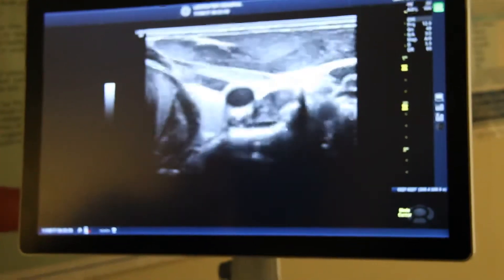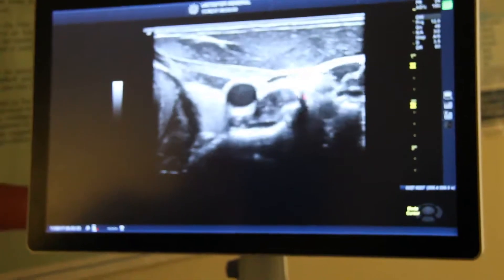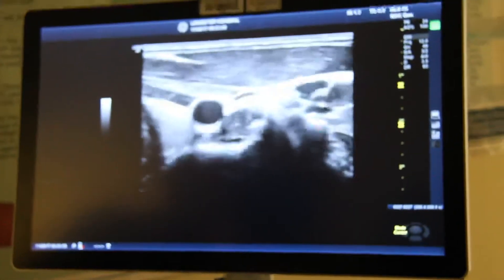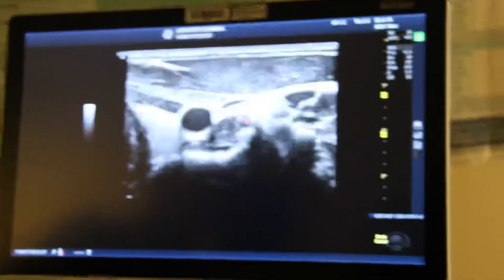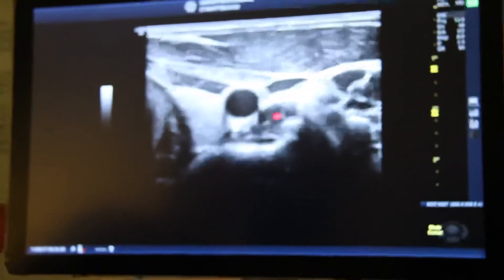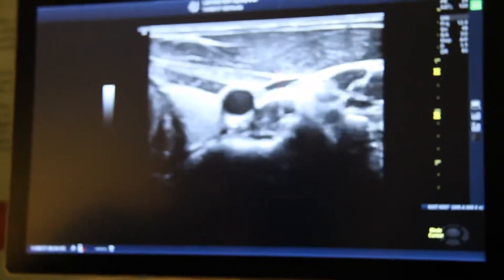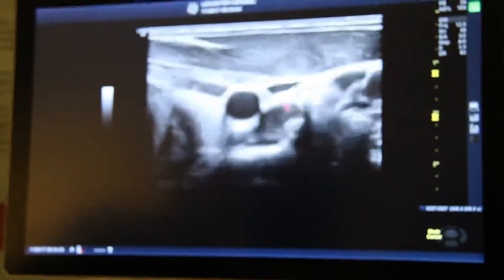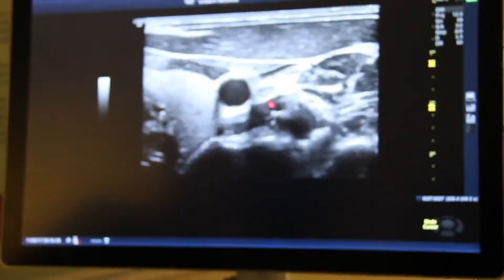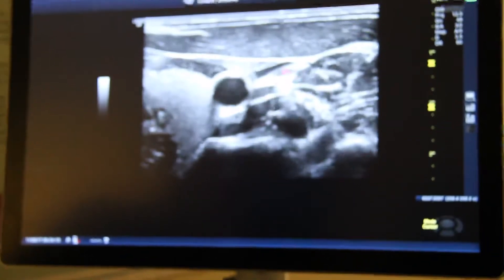Once I find that, I start to move my probe up looking for the anterior tubercle. As you can see, there's a very prominent anterior tubercle here — that's your C6 nerve root and that's your posterior tubercle. The muscle you see in that area is your longus colli muscle. Underneath your internal jugular vein, you can see a very white layer — that's your pre-vertebral fascia. The top muscle is longus capitis.